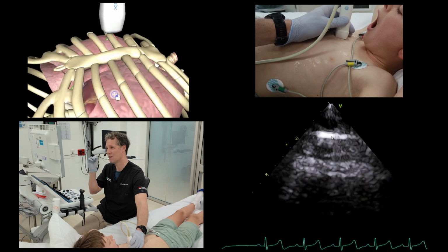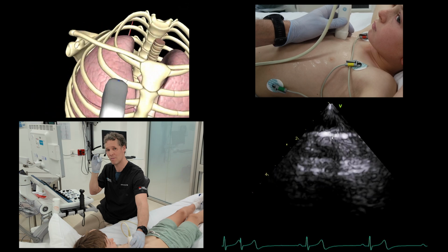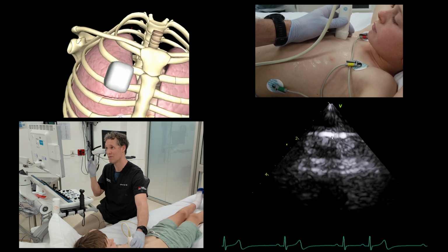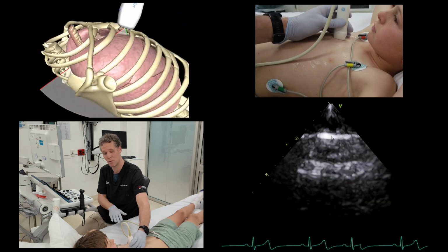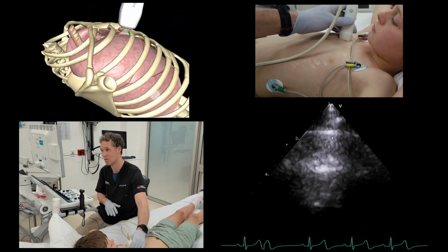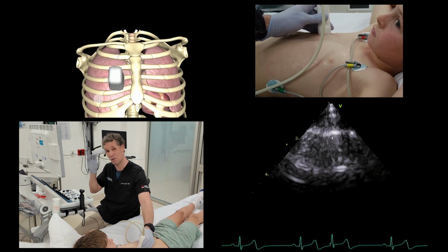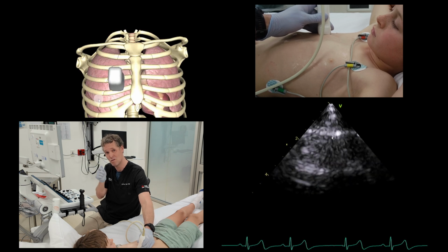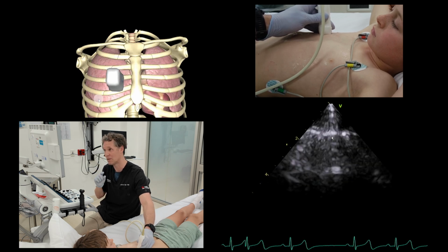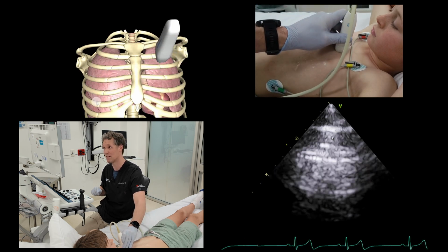And this speckling movement is what's called ants marching. It's the visceral and parietal pleura coming over each other. And that's a sign that you've got no pneumothorax. It's obviously going to happen in the most anterior portion for patients who have pneumothoraces. So you can slide down to get what's known as the lung point sign. Sometimes if you see a pneumothorax, try to find where there is visceral and parietal pleura against each other, so normal pleural interface, as opposed to where the pneumothorax is. And you can look on the left, on the right, on the left as well as the right.